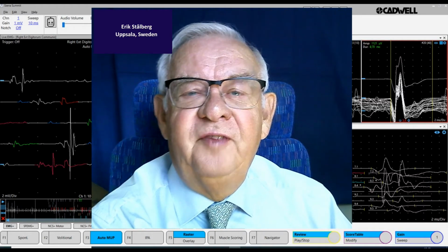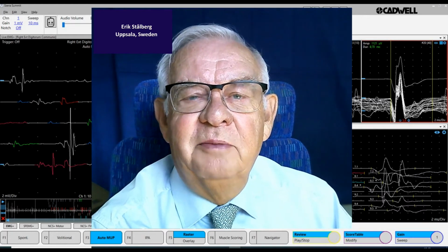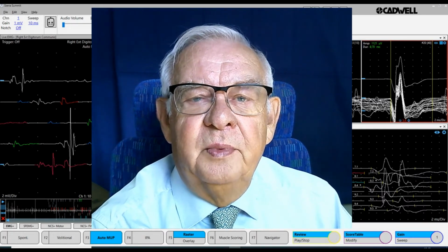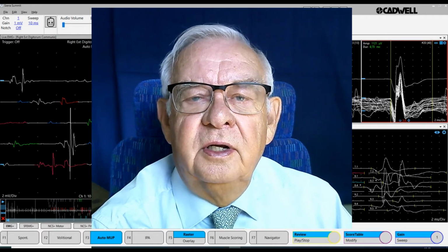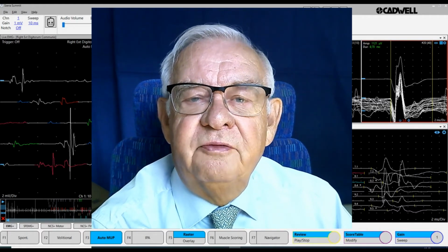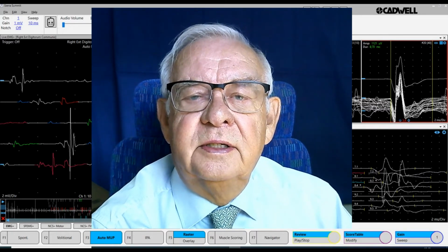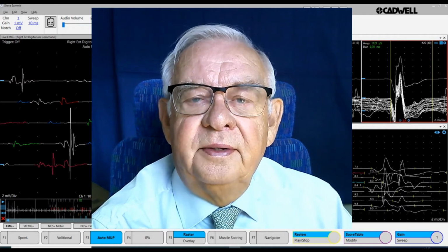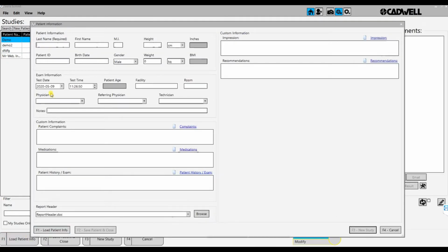In this short video, I'm going to show some aspects of quantitative EMG. We will start with the triggering of the motor unit potential and then discuss recruitment firing analysis, multi-MUP analysis, and interference pattern analysis.